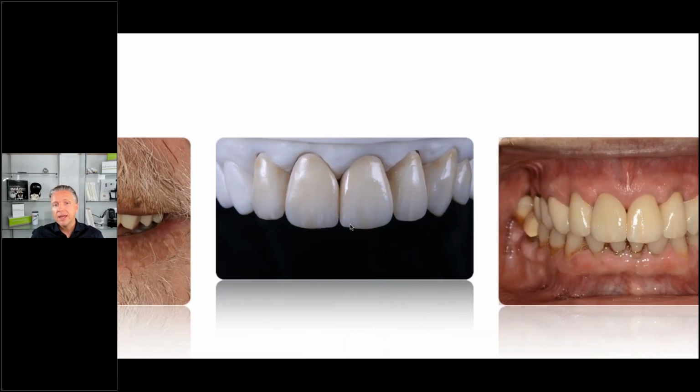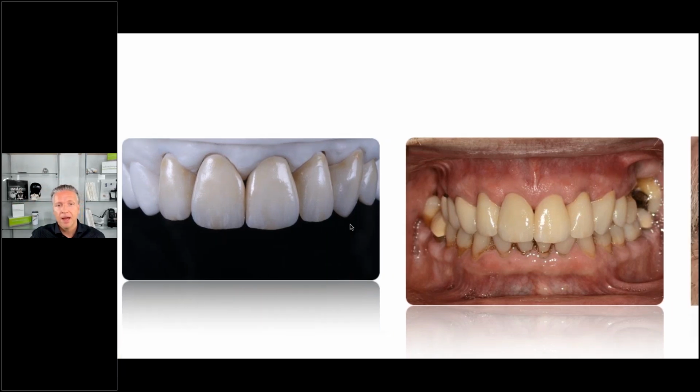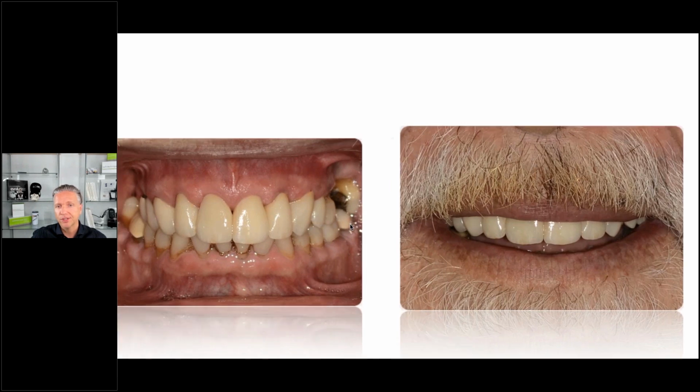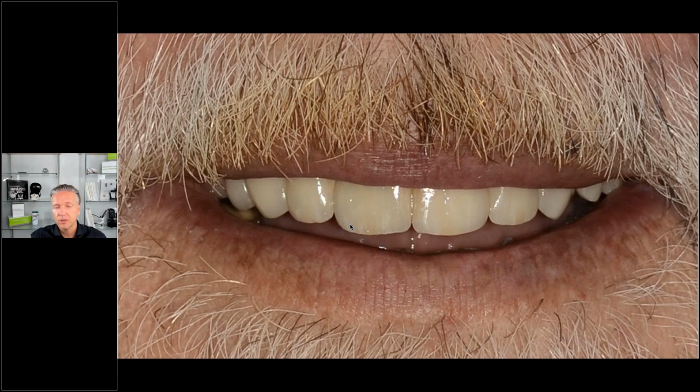And then I'm creating GC LiSi crowns as we did here, or veneers. Crowns, that's a mixed case, by the way, crowns and veneers. So here, these are monolithic restorations. There's nothing layered. We're just staining and glazing with some effects to create that natural look. And here we see the final outcome. The patient was very happy, and he can't wait to do the lower now. That's how we work, and it's very straightforward if you work very closely with your clinician. Usually I put a little bit of orange in the incisals to give the teeth some vitality, and they came out really natural and nice.